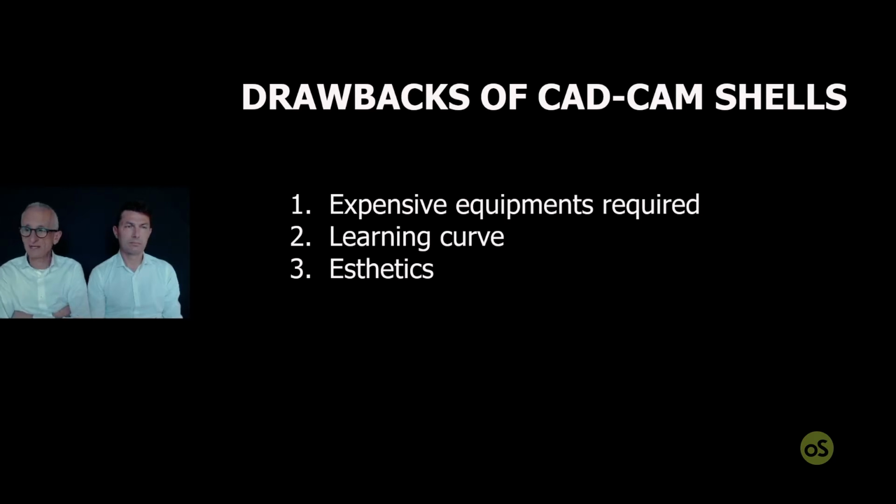Learning curve. Learning curve because you need to learn a software, and sometimes these software are not so easy to understand, and you require some training and time. And very often the software are upgraded continuously, and sometimes the upgrade is very good, but it forces you to start back to learn the new software. So basically, it requires a little bit of time.